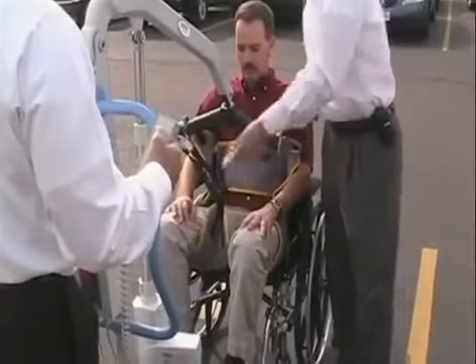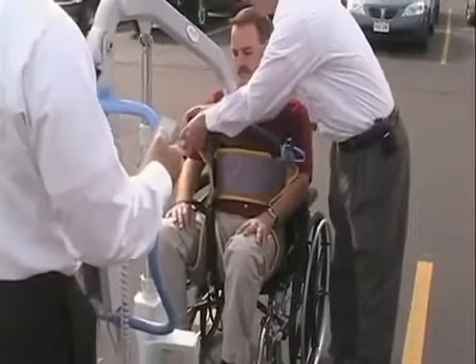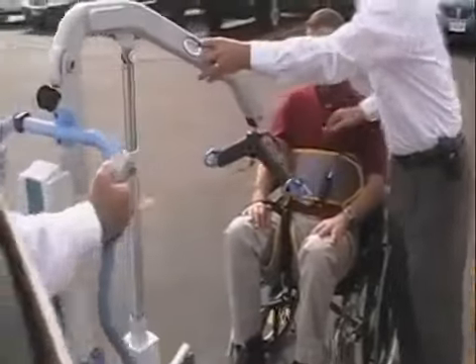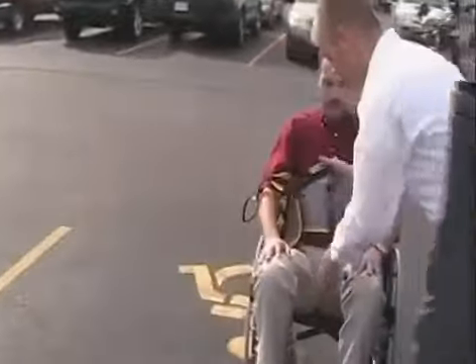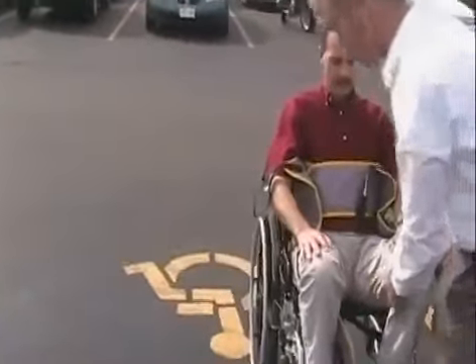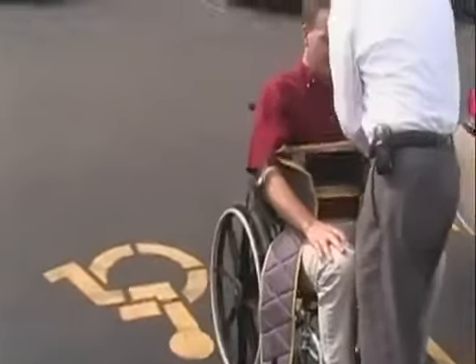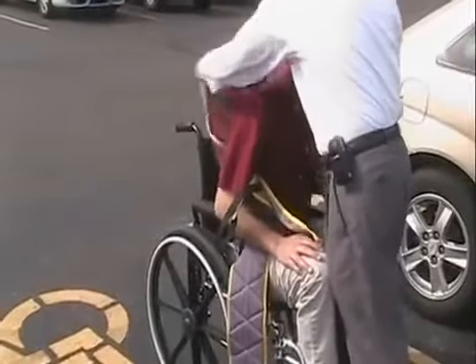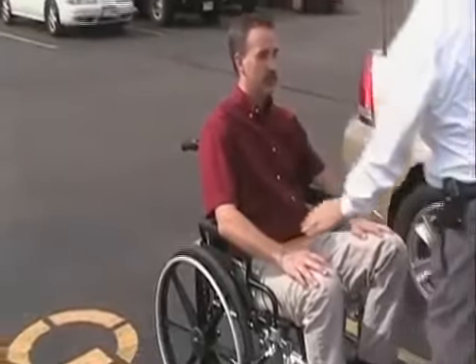Now I'm going to start taking these leg straps off. Take off the first one, the second one, the third one, the last one. I'm going to take this pull off. I'm going to uncross the leg straps — actually tuck the legs down and away, draw one side, and then do the same with this side. I'm going to draw both sides out. Now the last thing I'm going to do is lean you forward and draw this out from one side to the other. Are you comfortable there? Alright.